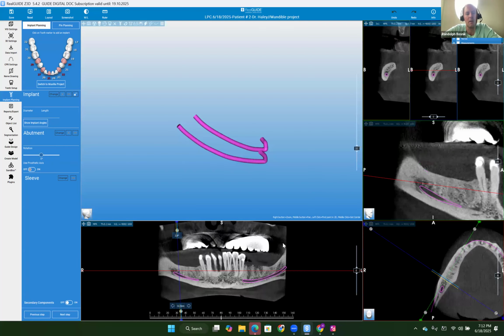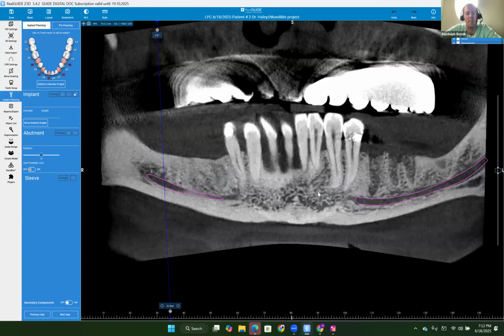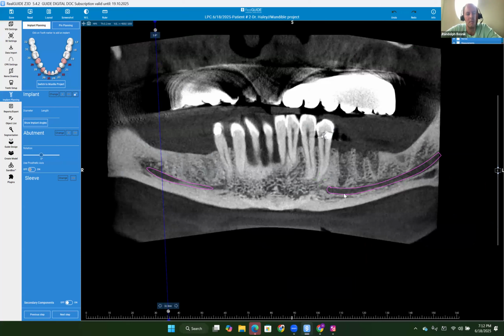So your plan here is to do an All-on-X FP3 prosthesis, Doc? Hopefully, yeah, that's the plan. I haven't done a whole lot of these, and the last one I did, somebody else placed the implants, but I had help with the prosthesis. Okay. And have you done many guided cases, Doc? Some guided and some with a universal guide, or just other implants.